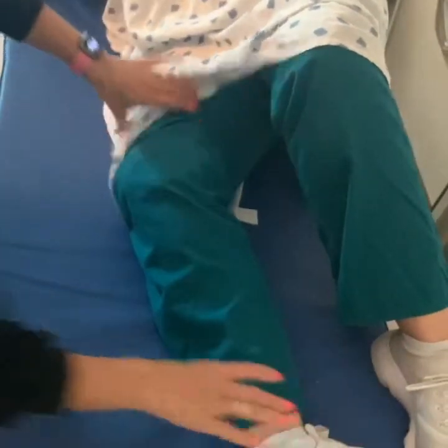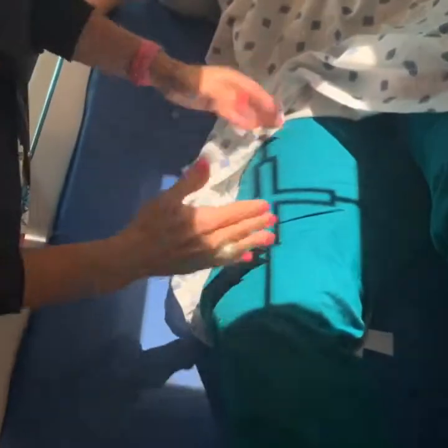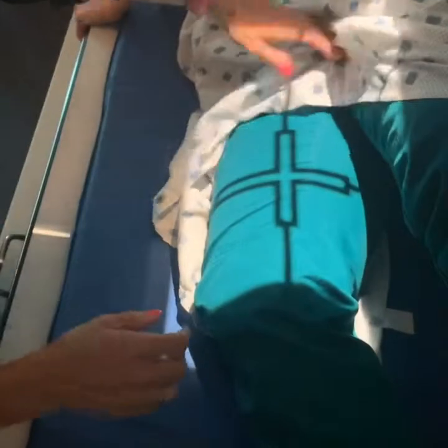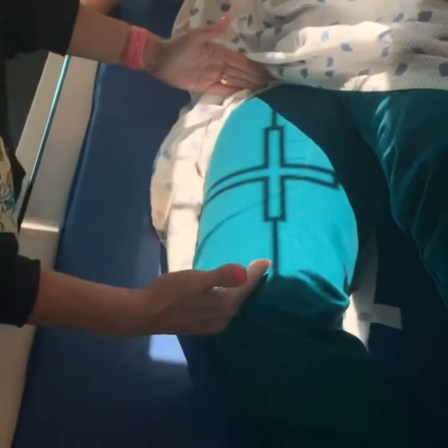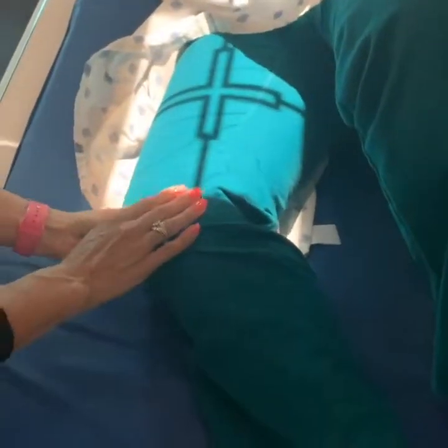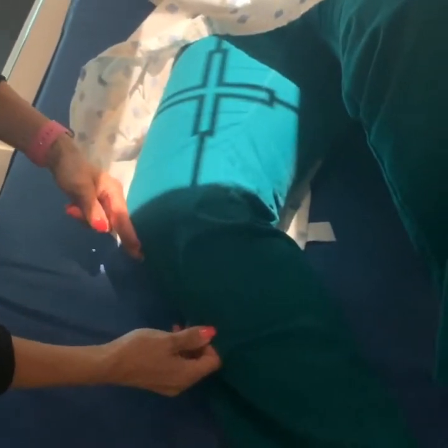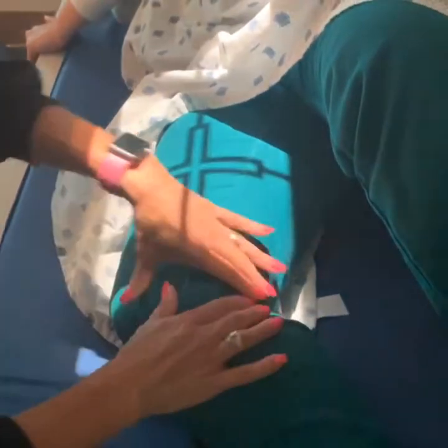And straighten. What you wanna try and do with this, like if you see her femur is not aligned with the table, so I wanna bring your hips towards me, good. I want this femur relatively straight. Does that make sense? Like you don't want her hips too far back, and you don't want her knee too far forward. So you're trying to keep everything aligned. Just like when you do a lateral knee, you want to make sure the patellar surface is perpendicular to the table, and you have to include the knee joint.